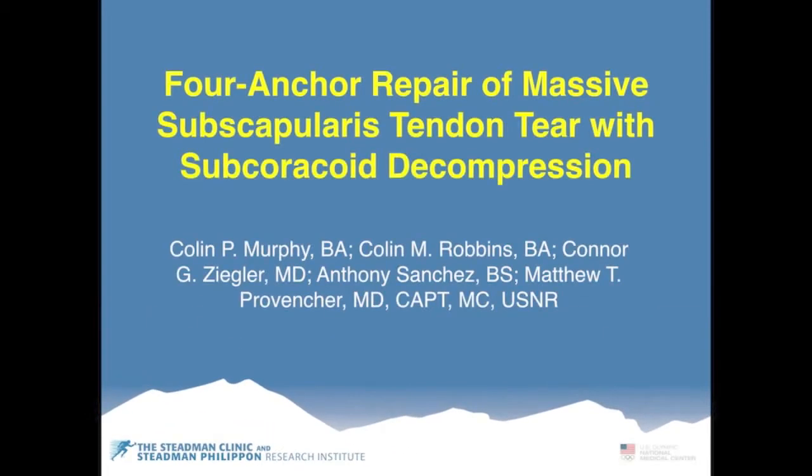Today we will be describing a 4-anchor repair of a massive subscapularis tendon tear with subcoracoid decompression.